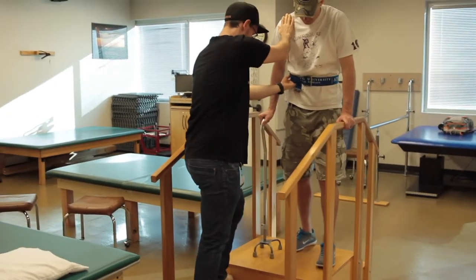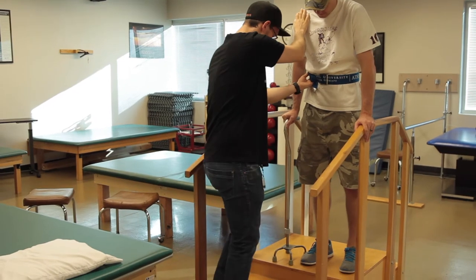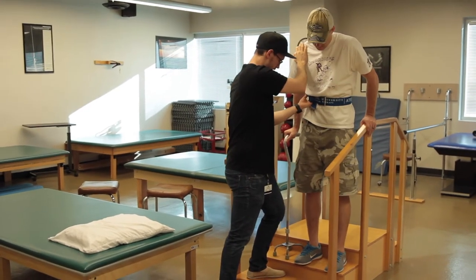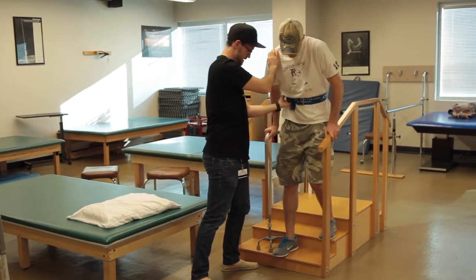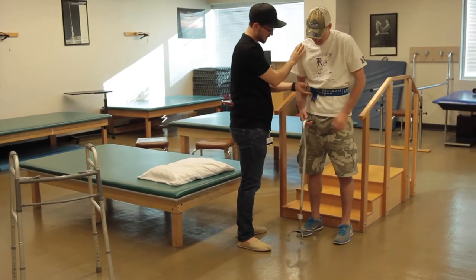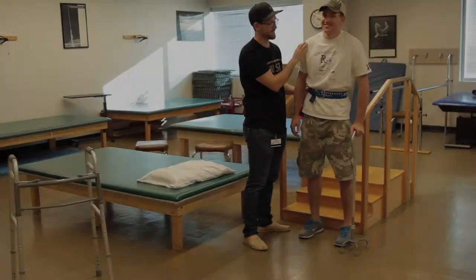All right, and come on forward. Now on the way down, it's the opposite. So put the cane down first, and then with the left, right, and then the left. Good. And then cane, right, and one more. Good. Do you have any questions, Mr. Ray? I feel great. All right. Good job.